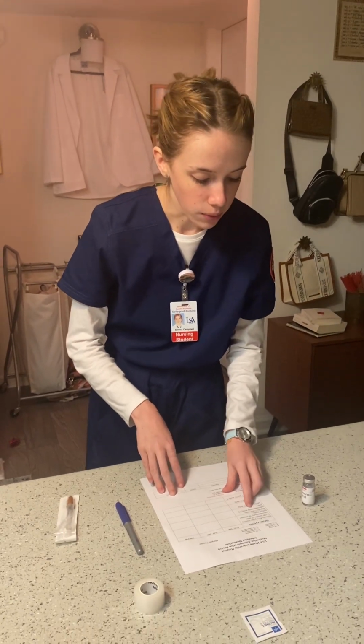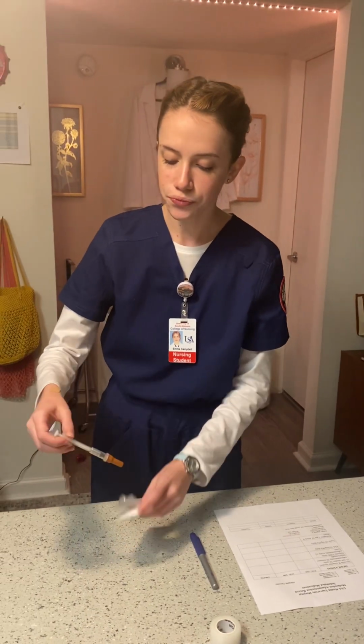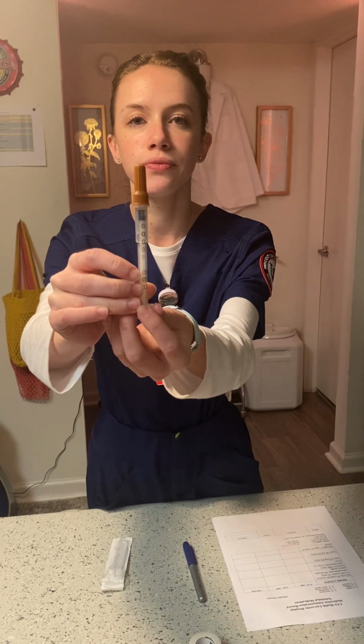We're going to see that the right route is subcutaneously. So right here we have got our TB syringe. This TB syringe has a 28 gauge needle that's a half-inch long. Typically for heparin though, to administer, we would use a 25 to 27 gauge needle. And I'm going to go ahead and show you this TB syringe now.